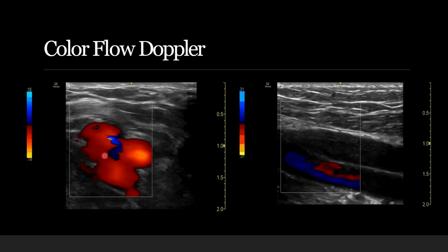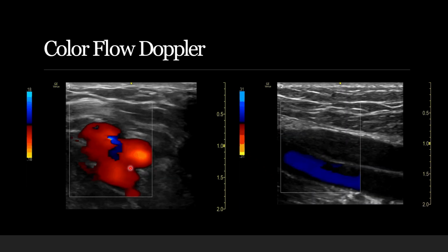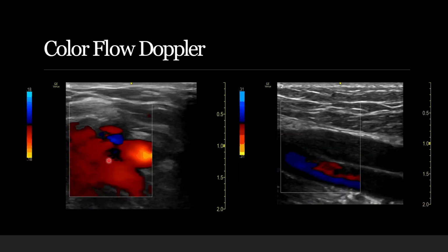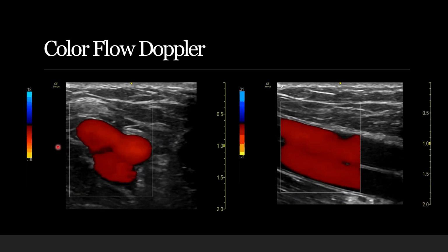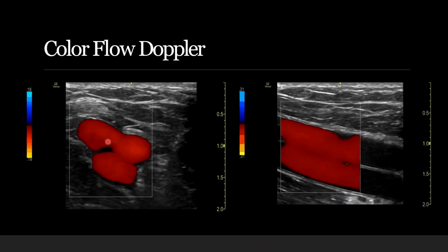Deep to that, we've got our artery. You can see there, it's constantly flashing. With that augmenting maneuver, I'm actually causing it to go outside of this scale, so that's why it flashes red. But generally, you notice this is mostly blue, while the veins are mostly red, so it's going in the opposite direction of Doppler shift as opposed to the veins above it.